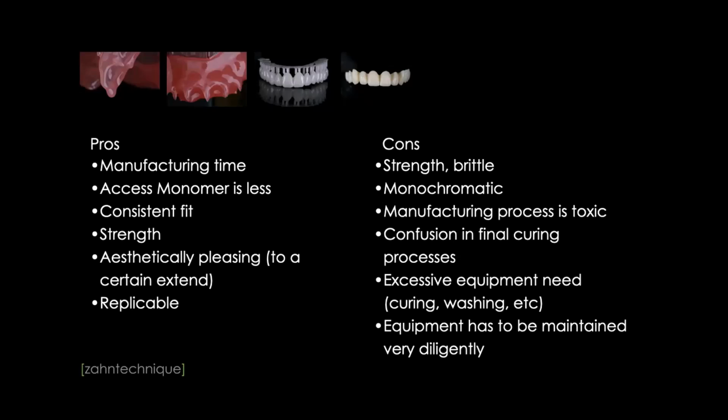Excessive equipment is needed. I already mentioned we need different curing machines, different curing chambers. We already have 2 or 3 different ones here, and we most likely will have more over the next years, as we have more different resins. Then you have to wash it, all these things. And I think the biggest con is that somebody has to maintain that equipment, right? That's the biggest deal.